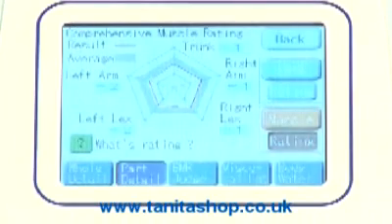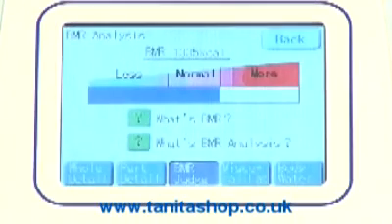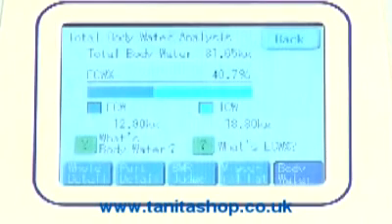Muscle rating indicates the individual's readings compared to average readings. Basal metabolic rate shows how effective the body is at burning calories. Visceral fat indicator and rating, and total body water indicating the extracellular and intracellular percentages and weight.